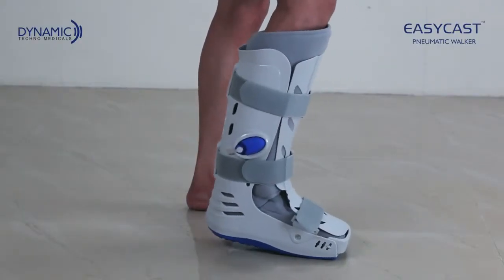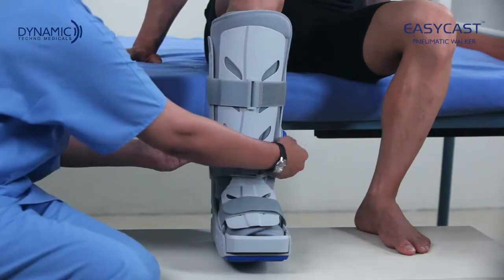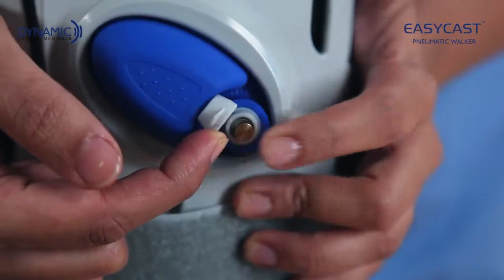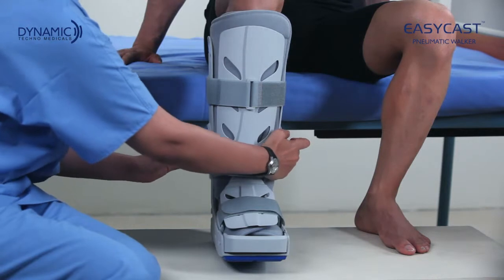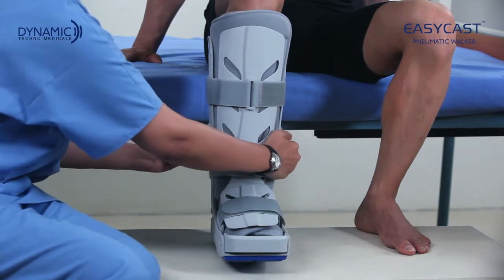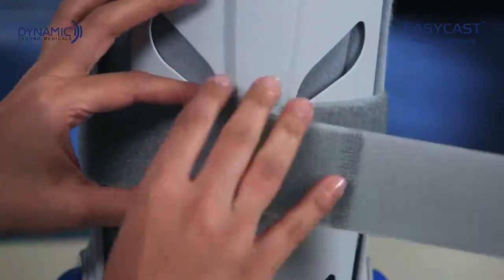The patient can now walk. To remove EasyCast, first open the cap of the releasing valve and press the valve to deflate the airbags. Then unfasten the straps in the front, starting from the top strap and going down to the bottom.